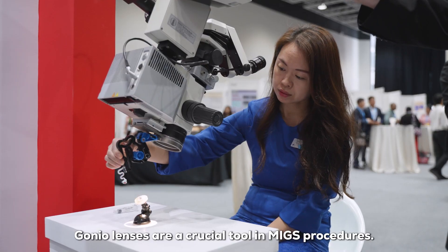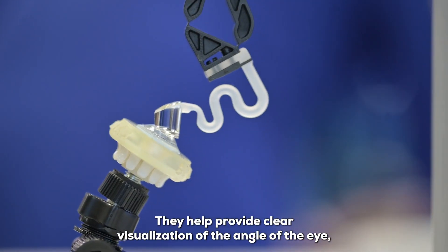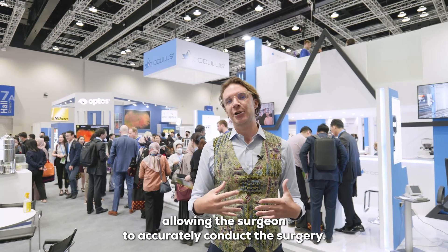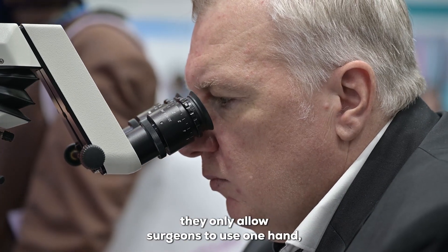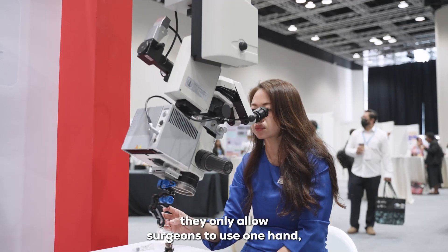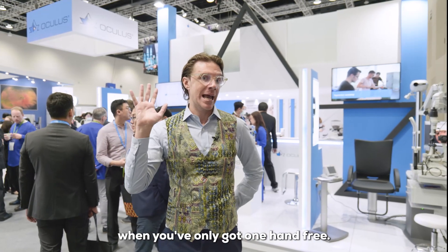GONIO lenses are a crucial tool in MIGS procedures. They help provide clear visualization of the angle of the eye, allowing the surgeon to accurately conduct the surgery. The current challenge with GONIO lenses is that they only allow surgeons to use one hand, and it's really tough to get the job done right when you've only got one hand free.